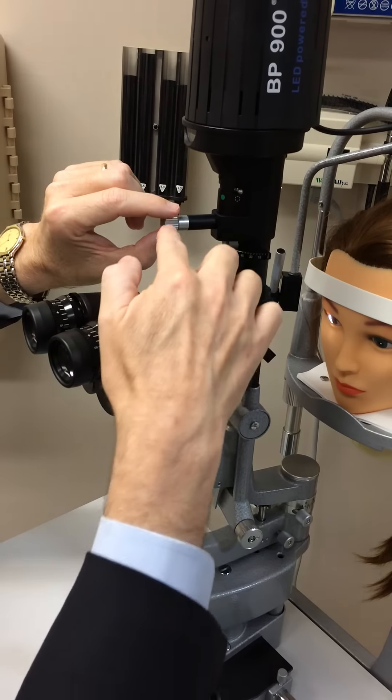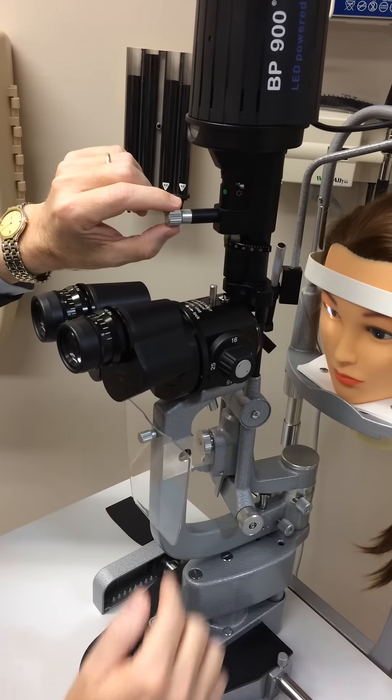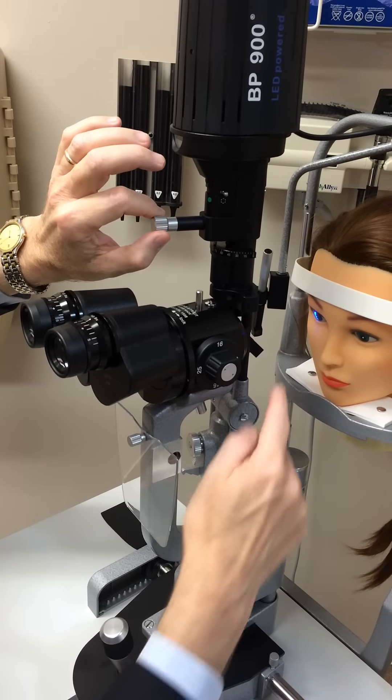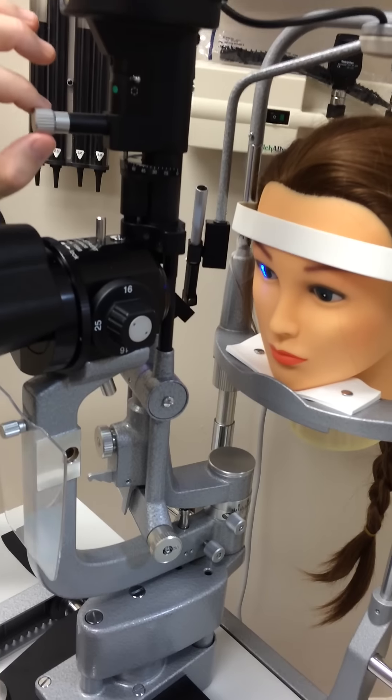This is the difference on this lamp. The cobalt blue light for using fluorescein is on this thing. You have to turn it all the way to the left and it clicks in. Now you can see the cobalt blue on the eye.